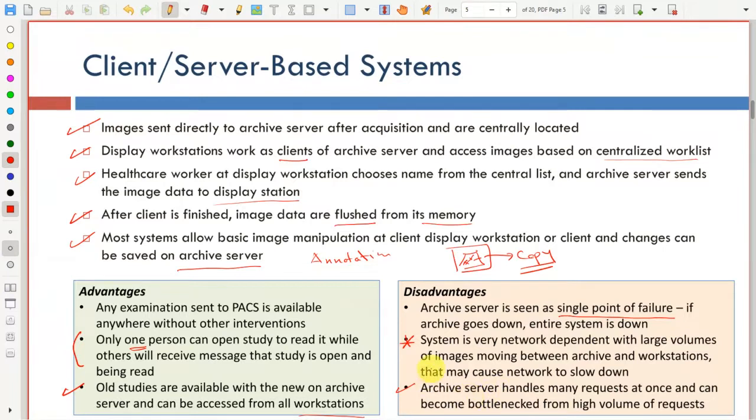Of course, if you want to solve these kinds of problems at the network, and the reliability and the ability to handle many requests, the cost of the system would be a little bit more expensive, because you have to duplicate things and design things with high-end equipment rather than regular equipment. So all these disadvantages are definitely technical, but there are solutions to them.